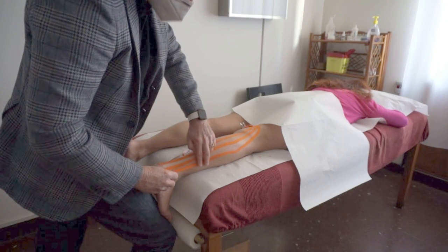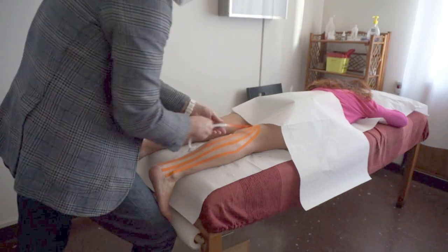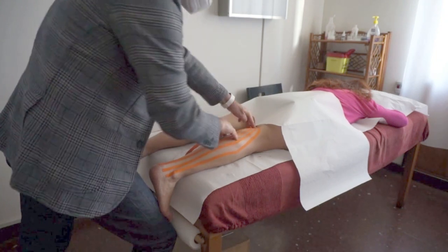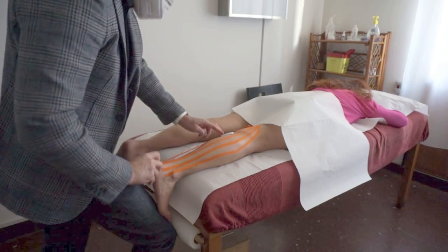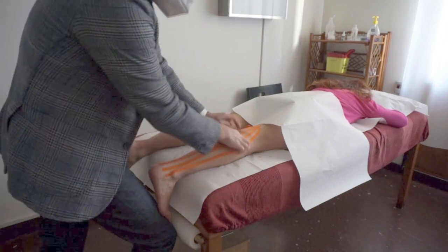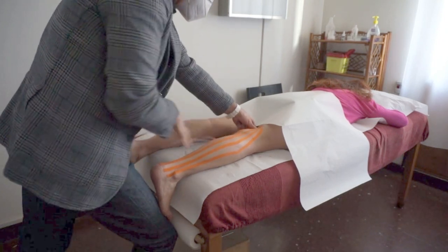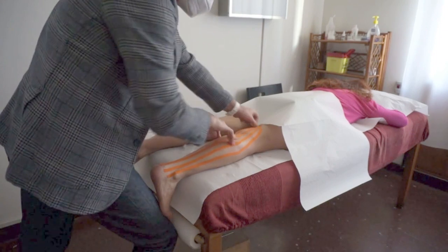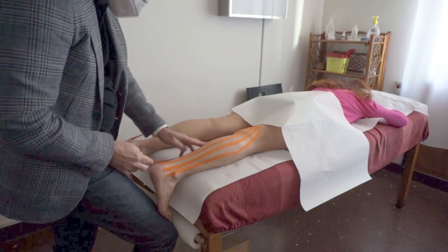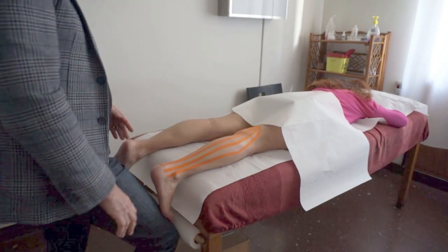As you see here, I'm applying the tape over the skin posterior to the lower limb and we have to put the skin into a stretch position. Consequently the foot is in a dorsal flex position, the knee is extended, and the tape is being applied at zero tension — meaning the tape is not stretched in any way. The distance between each one of the strips is between 1 and 2 cm, which means we are covering between 30 and 50% of the surface area — one of the main principles behind neuromuscular taping for the best therapeutic effect.